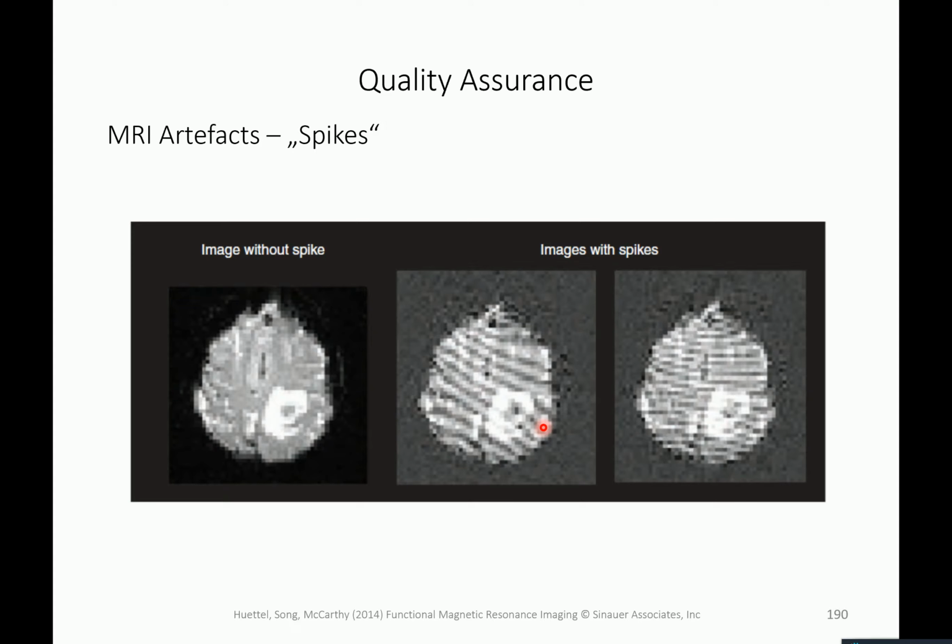This is called spikes. This usually doesn't occur in all images, in all slices, but occasionally occurs and in general signals some malfunction of the hardware and is one of the times where you would call the vendor of your machine to check out what is going wrong, because as Christian Kainz also discussed, this is not something that we deal with ourselves, but the Siemens people have to come if there are spikes and check what the problem is.